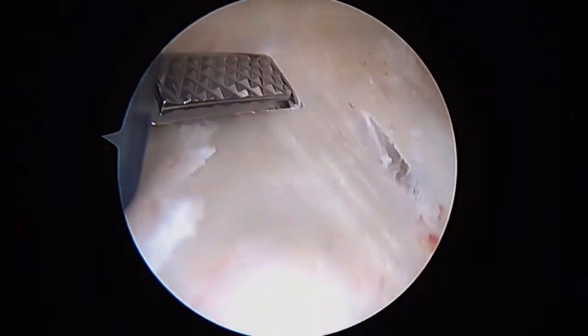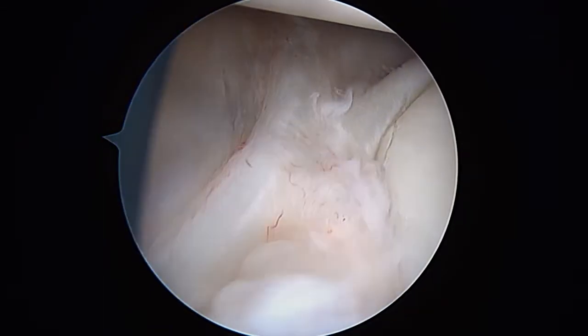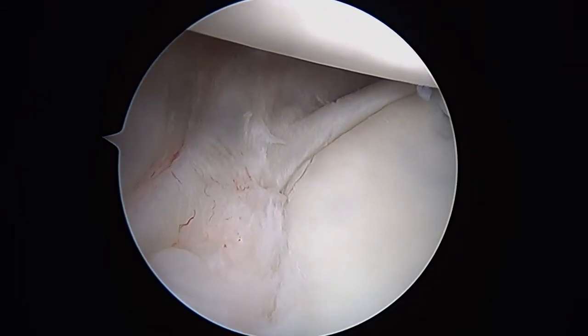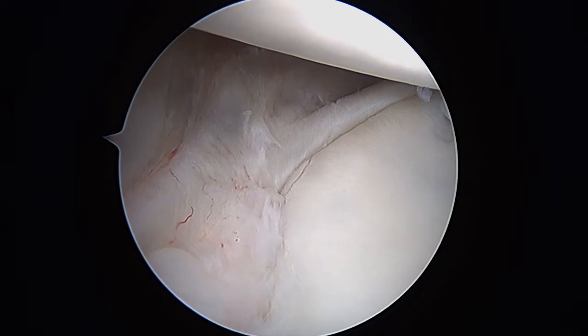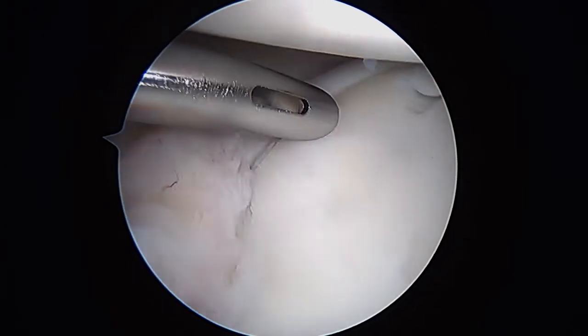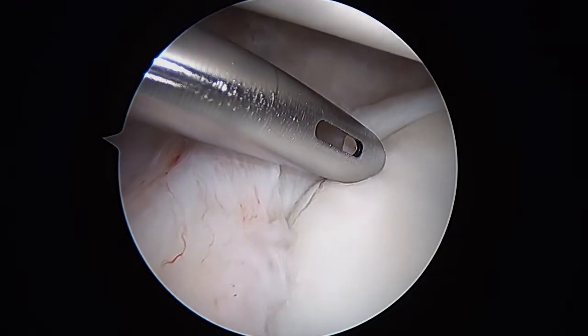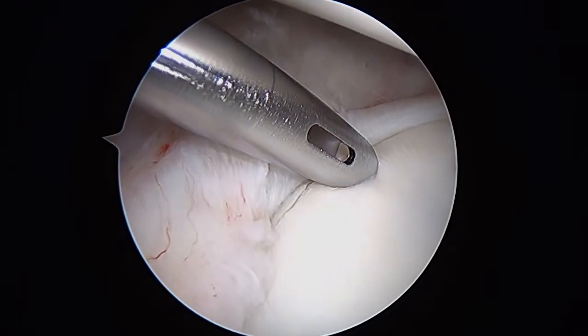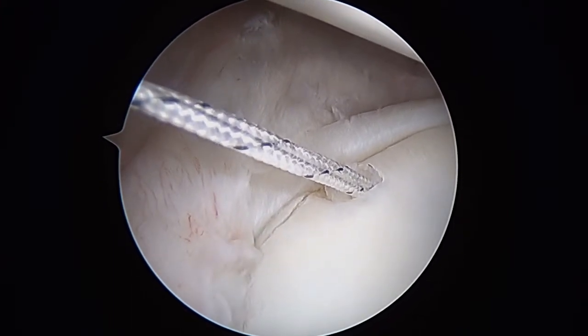After doing this a little bit, we're now going to take our drill guide with the blue handle and go right in the middle. We'll go ahead and place this guide down, and we're going to try and get an anchor in right about here. That's what the anchor looks like when it's down in the bone — I'm happy with that.